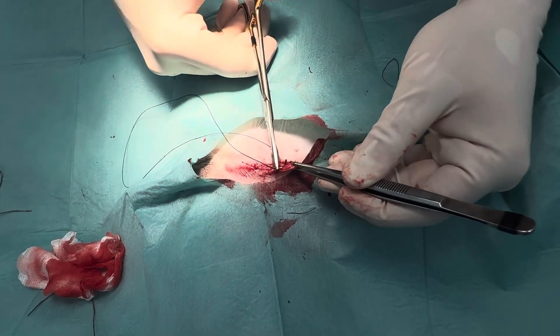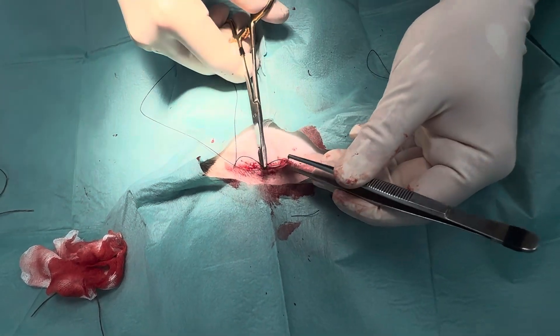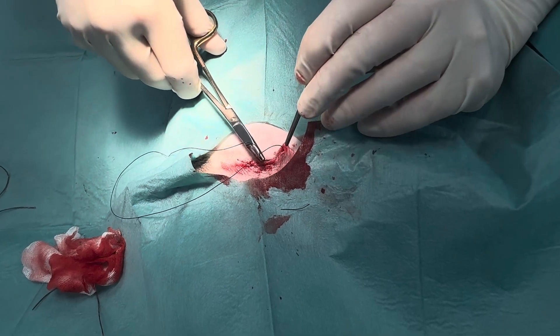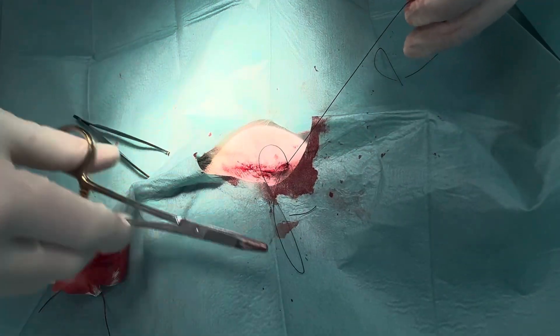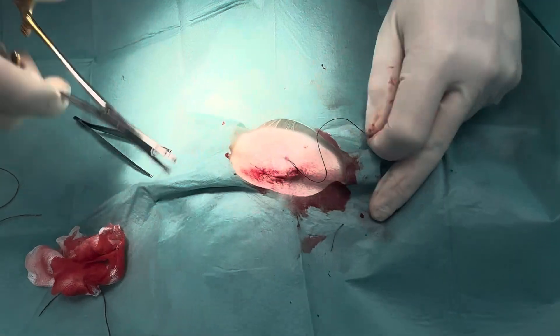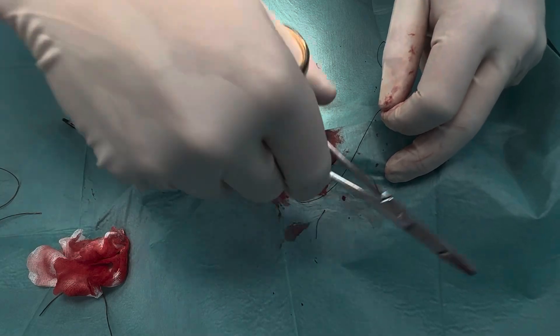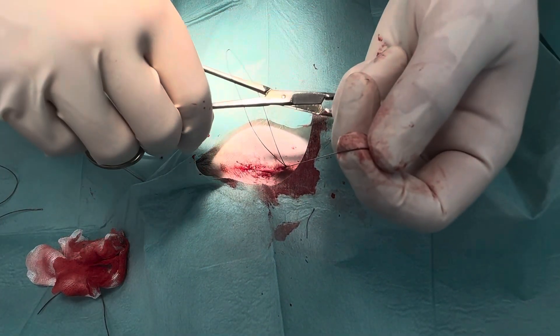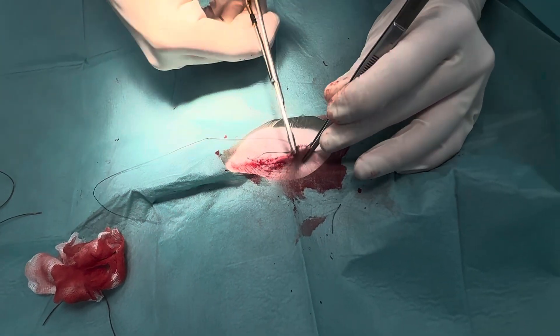The tissue will clot very quickly. Just finishing up our knot, and we're going to do our Aberdeen knot. We have this dog come in between two and five days for a recheck to check everything looks good — no swelling or signs of infection, which is very rare in this surgery. But the biggest thing is monitoring for swelling. Herniation is probably the third most common issue I see in this surgery, if the layers aren't closed properly — you will have to go back in and close them again.